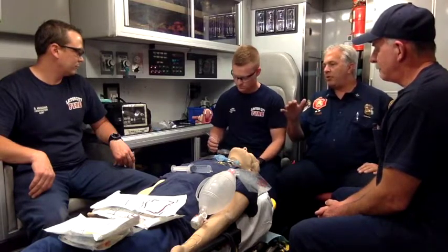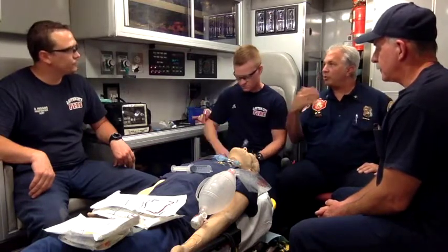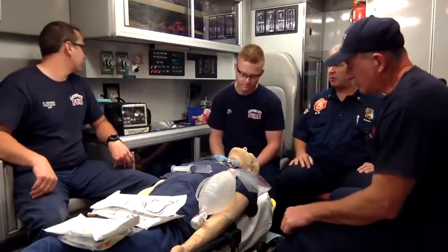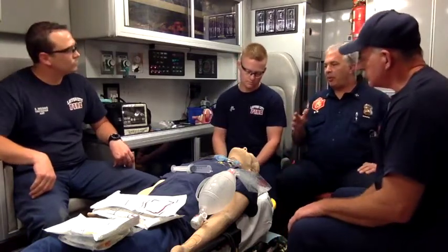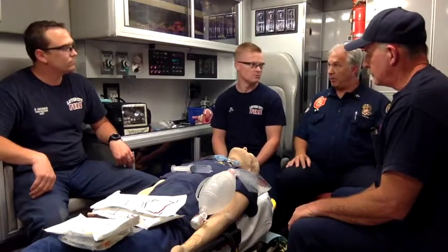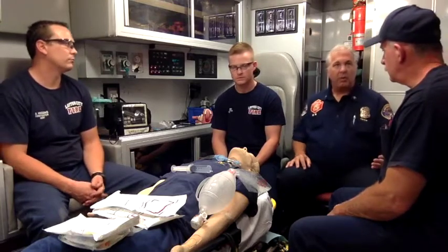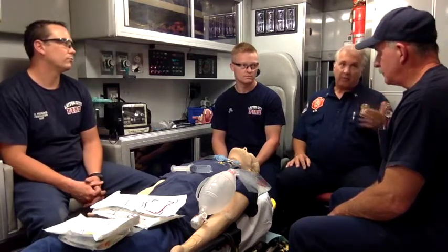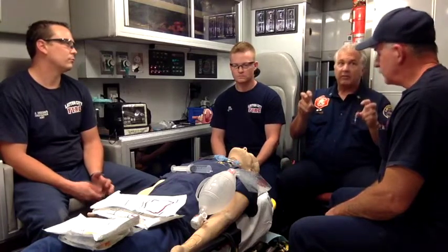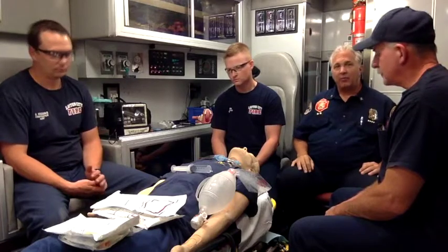So we mentioned that an unconscious, unresponsive overdose, or a trauma patient maybe that's not in cardiac arrest, or a cardiac arrest patient that we use it on. The other place, and in fact the reason supraglottic airways started in the hospital environment, this will blow your mind. You and I have been around for a little while. We haven't always carried all these things. I'd consider them a new device. Take a guess at when the first supraglottic airway was invented.